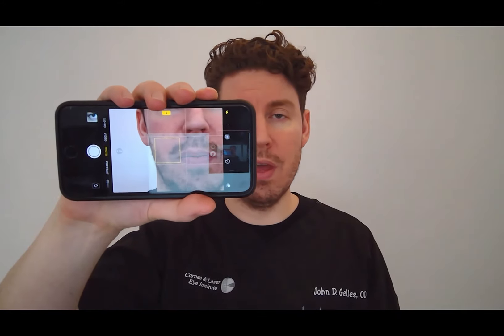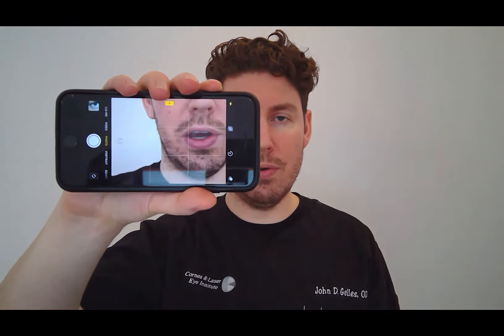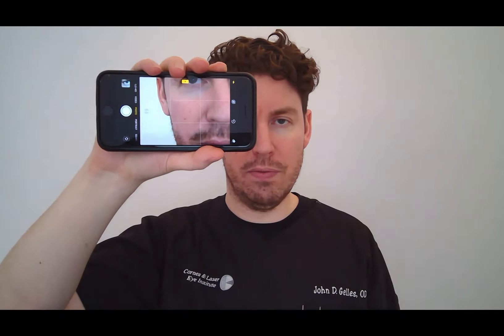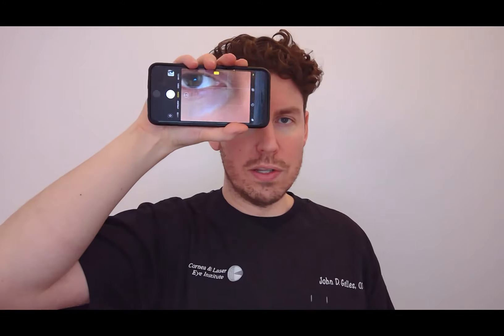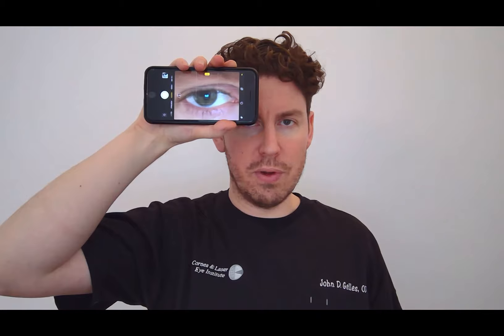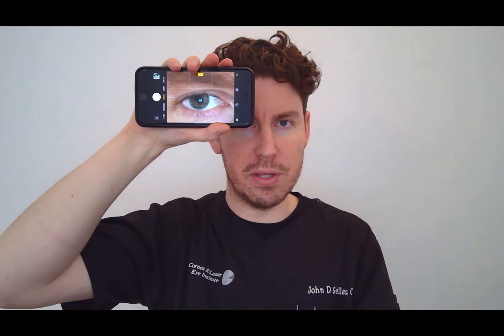Once you've done that, you want to go ahead and hold the phone up in the horizontal orientation. Once you're there, I want you to go ahead and start bringing the phone in towards your eye. You want to be about 4 inches away from the eye before you take the image. You want to make sure that your eye is nice and centered within the frame and it fills the frame. You can capture the image either by pressing the button or by using your volume buttons.